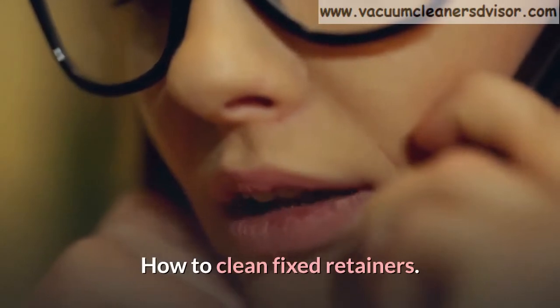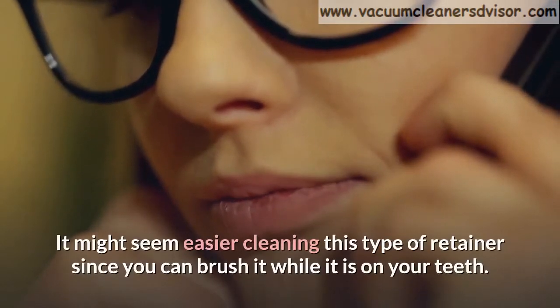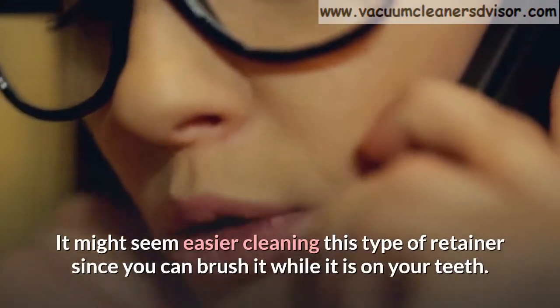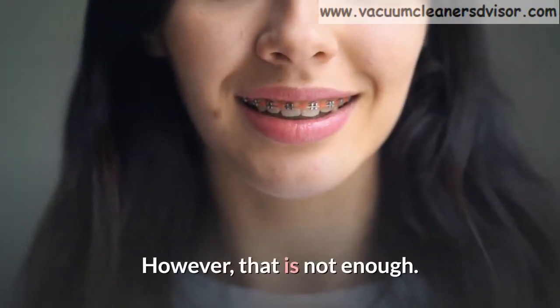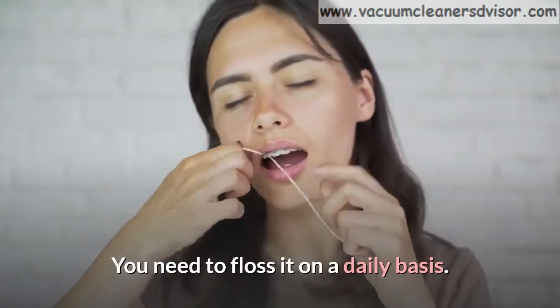How to clean fixed retainers. It might seem easier cleaning this type of retainer since you can brush it while it is on your teeth. However, that is not enough. You need to floss it on a daily basis.